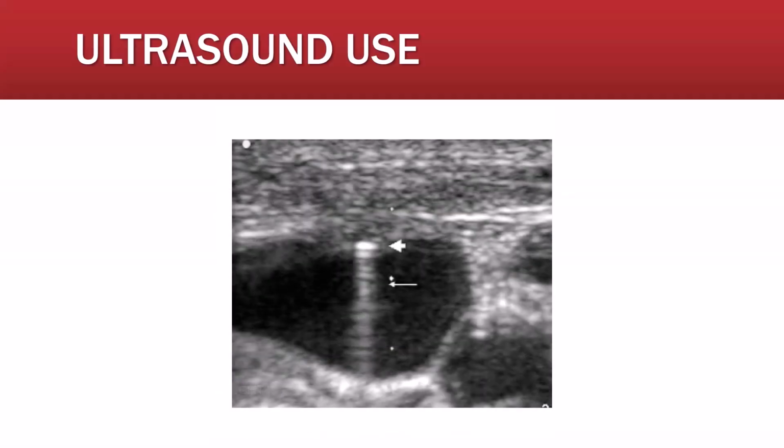Further use of ultrasound is the use of dynamic ultrasound imaging to identify the tip of the inserting needle. We're currently viewing a transverse window of a venous vessel. We're identifying the hyperechoic imaging of the tip of the needle penetrating the venous vessel.